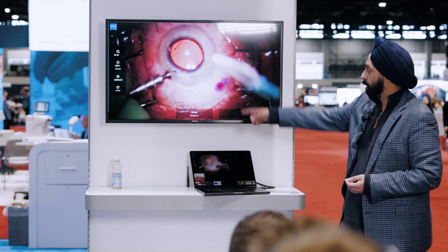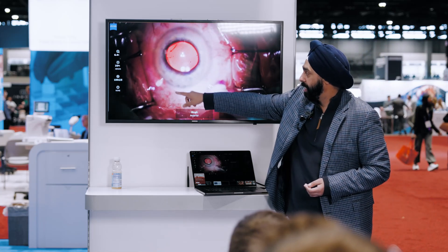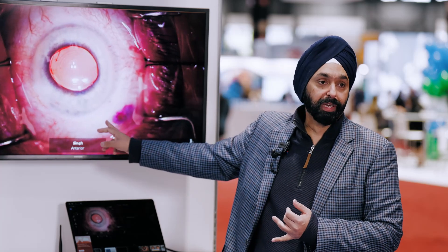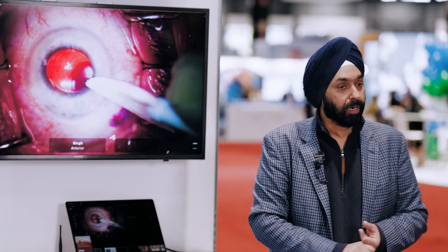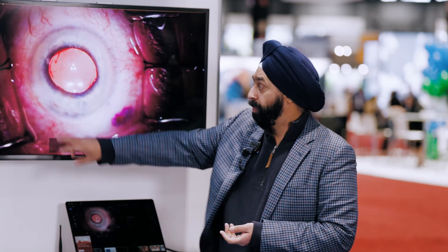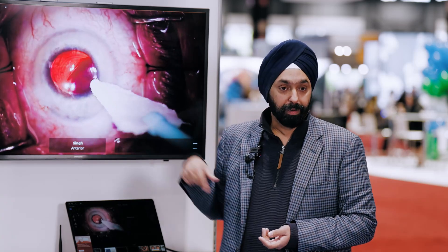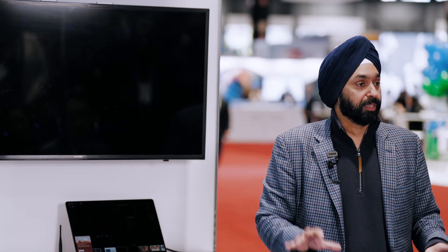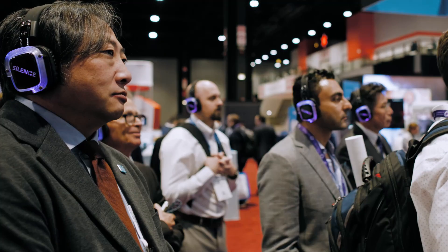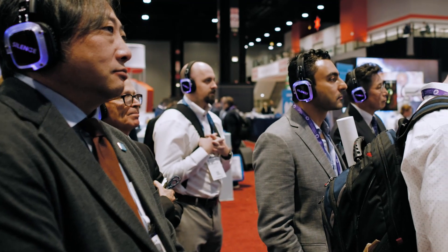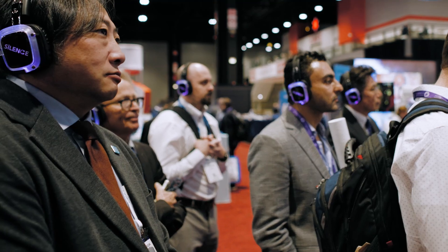Once we feel it's done, come out, take out the AC maintainer, and that's it. These patients do not need any suture. There's no cut down of the conjunctiva, no trocar, no viscoelastic — just an AC maintainer, go in, come out. I guarantee any anterior segment surgeon who does cataract surgery should feel comfortable doing this. From a surgical procedure perspective, it's very straightforward.